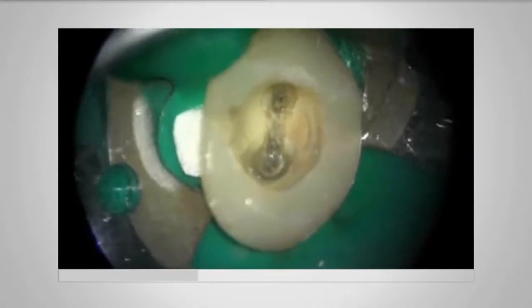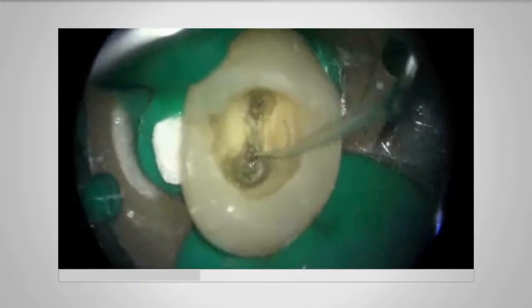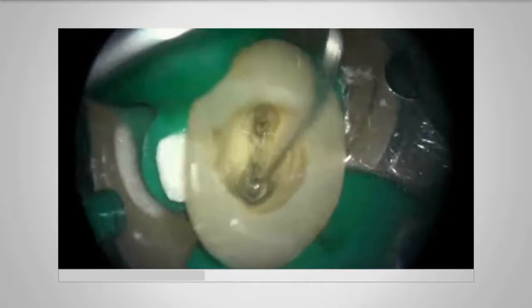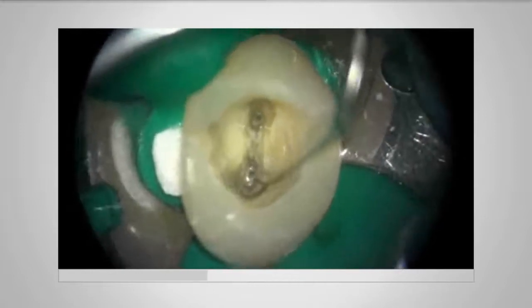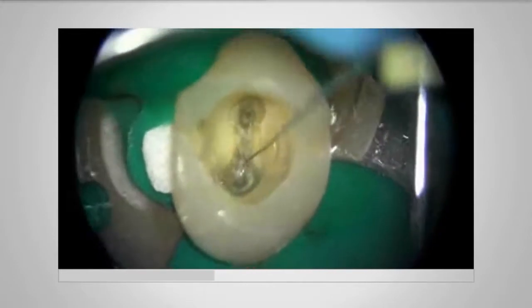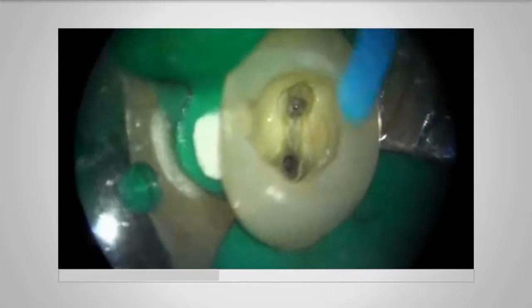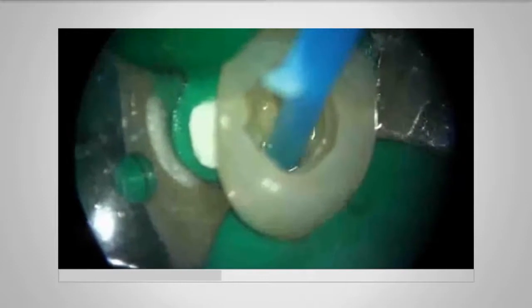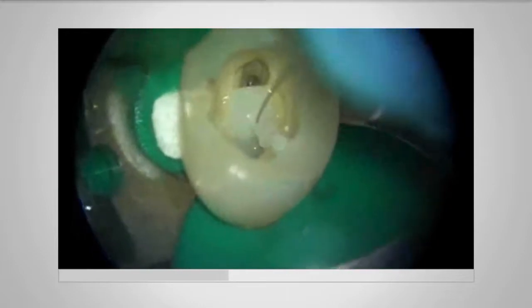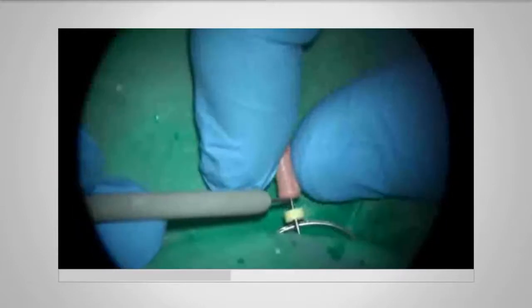Picking up the micro opener or endo explorer again, just to see if that orifice is patent. And again, this time with the size 6 file, looking into the root canal there through the hole that I made with the LN burr. A little bit of lubricant, and this is the only time I really would use lubricant. And now we're in the root canal.